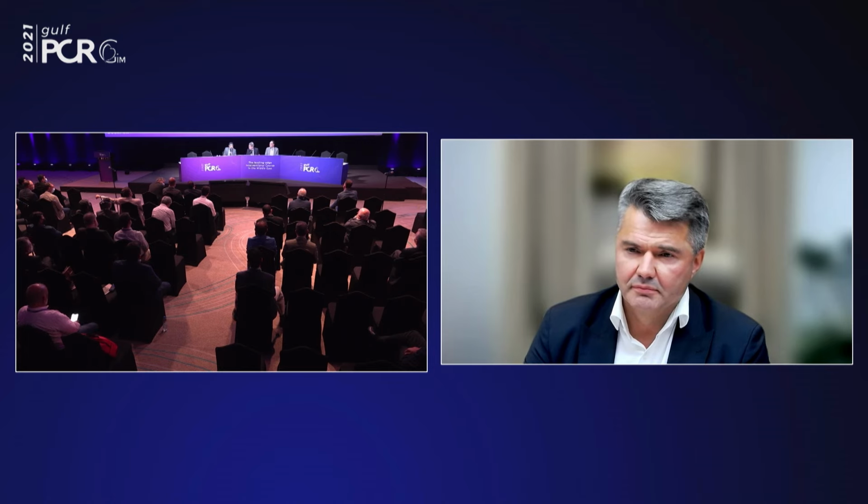Yeah. So it's been challenged because a lot of the studies that challenged it were looking at intravenous versus intra-arterial. We definitely find in patients undergoing coronary procedures, the risk is there. Nephrologists would say the risk is not as great as we are scared of, which is a valid point. However, when you've got patients with very poor baseline eGFR, when we're doing the sort of cases that we've demonstrated, we're giving them a lot of contrast, it will significantly increase their risk of contrast-induced AKI and ending up on dialysis, with a significant outcome in morbidity and mortality. So that debate is there with the nephrologists, but there are some important nuances with the evidence there.